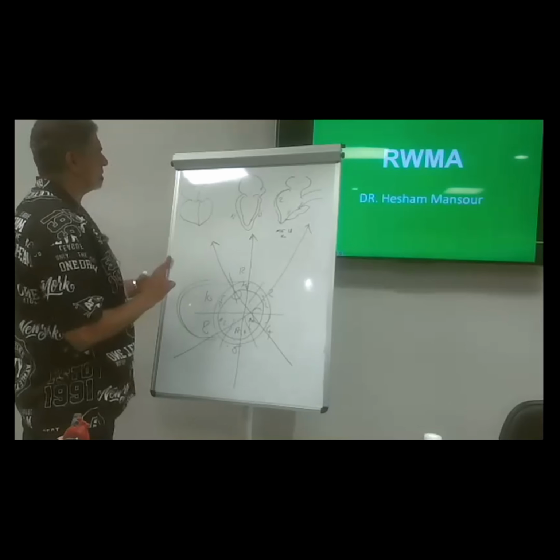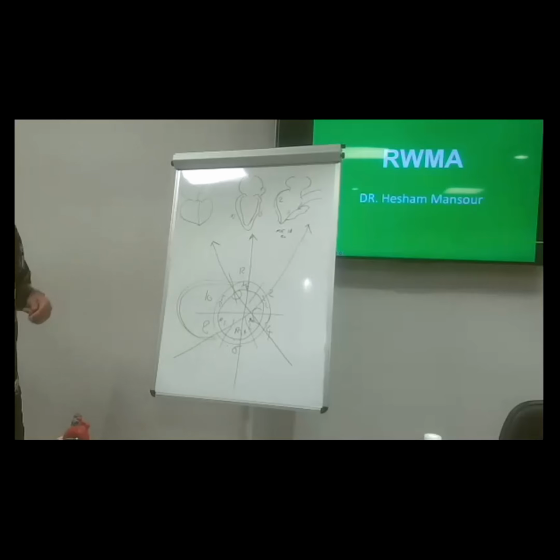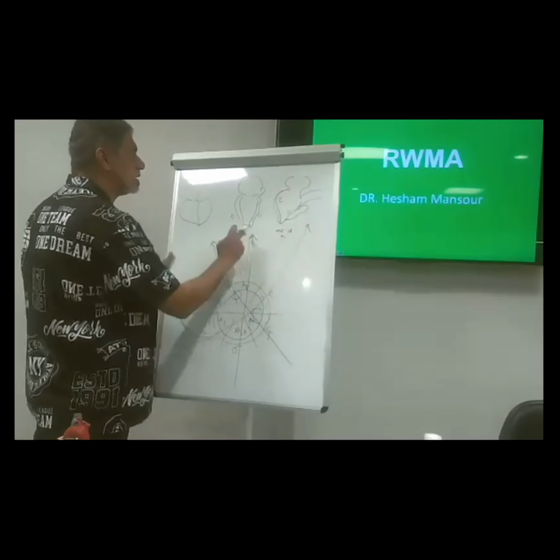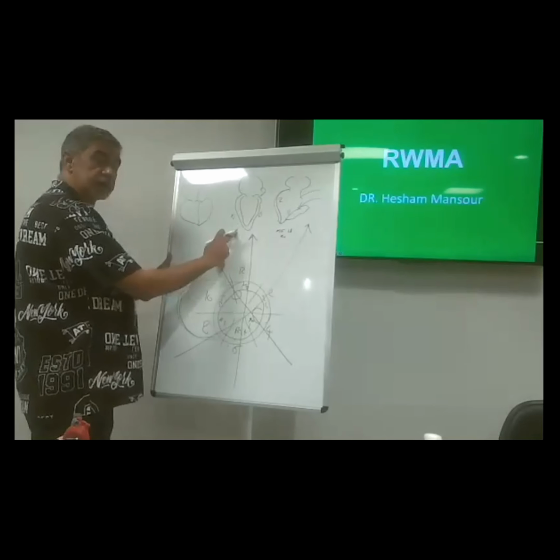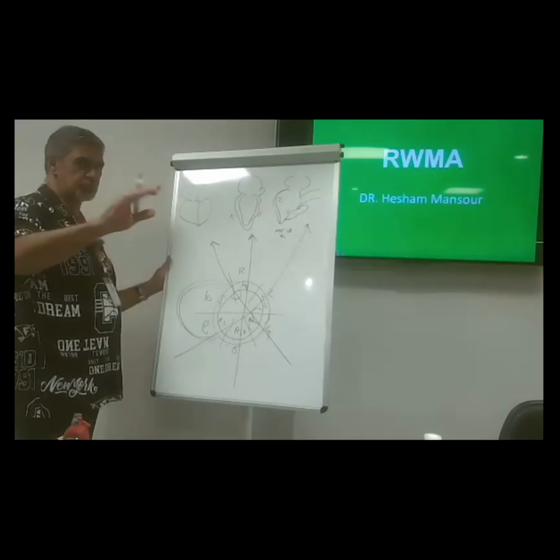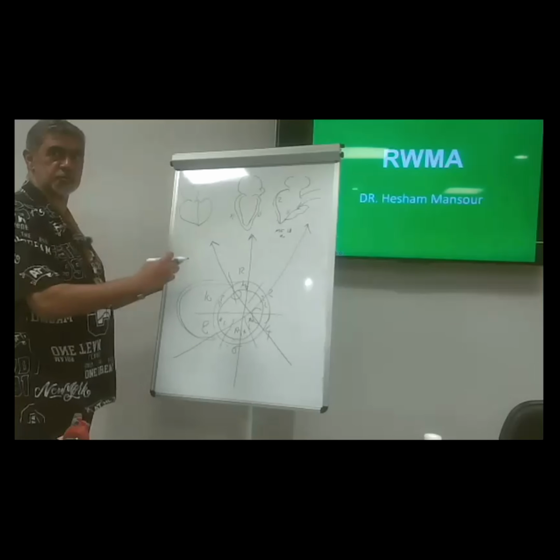Imagine it is a four chamber mid-esophageal. This is mid-esophageal long axis at 120. This is mid-esophageal two chamber at 90. This is mid-esophageal, everything is there, dear doctor. Don't bother yourself. Concentrate with me, please.